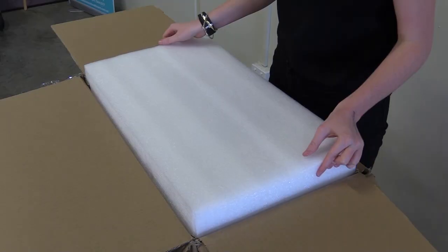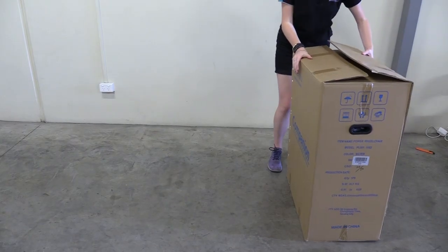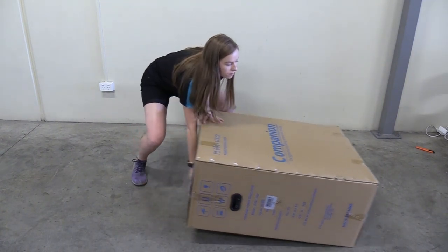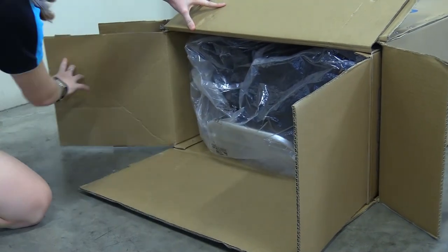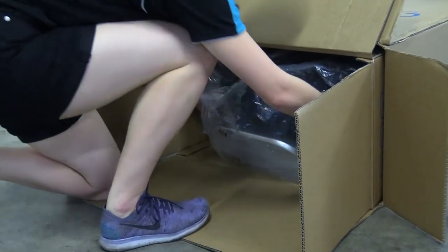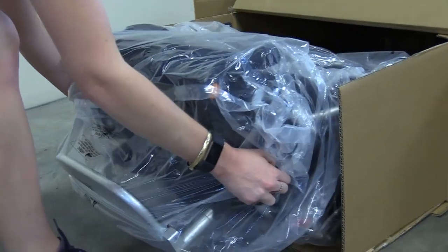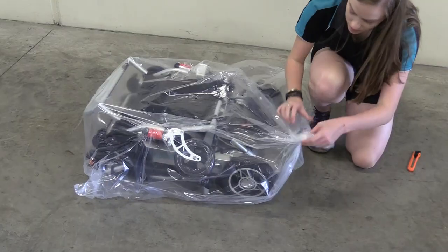Now that you have your brand new Companion, it's time to open it. Lay the box flat on the ground. Carefully pull the wheelchair from the box and remove all the packaging.